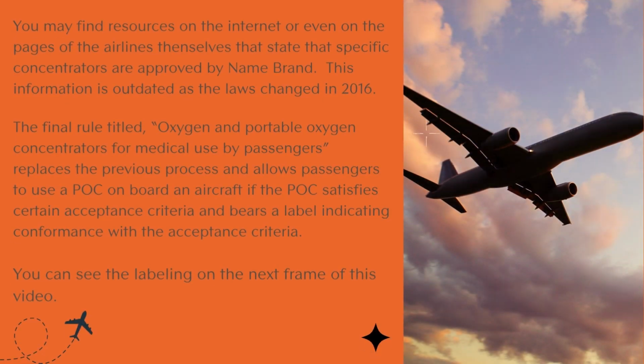You may find resources on the internet or even on the pages of the airlines themselves that state that specific concentrators are approved by name brand. This information is outdated as the laws changed in 2016. The final rule titled Oxygen and Portable Oxygen Concentrators for Medical Use by Passengers replaces the previous process and allows passengers to use a POC on board an aircraft if the POC satisfies certain acceptance criteria and bears a label indicating conformance with the acceptance criteria. You can see the labeling on the next frame of this video.